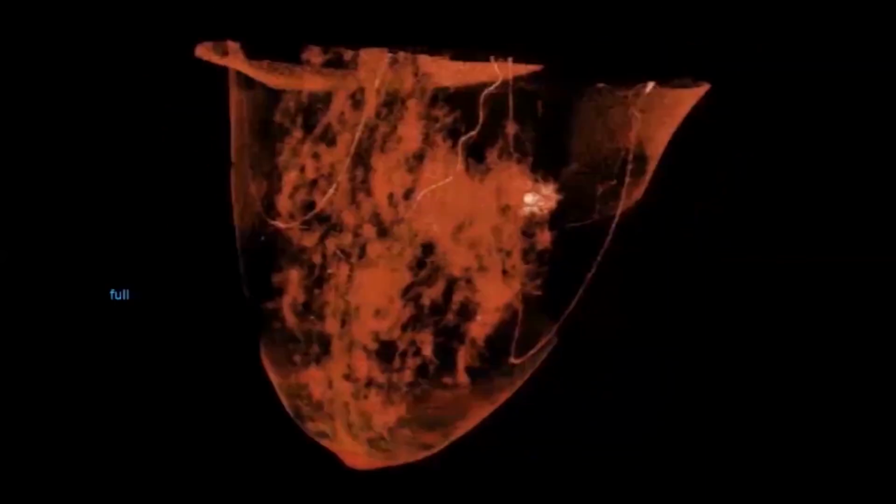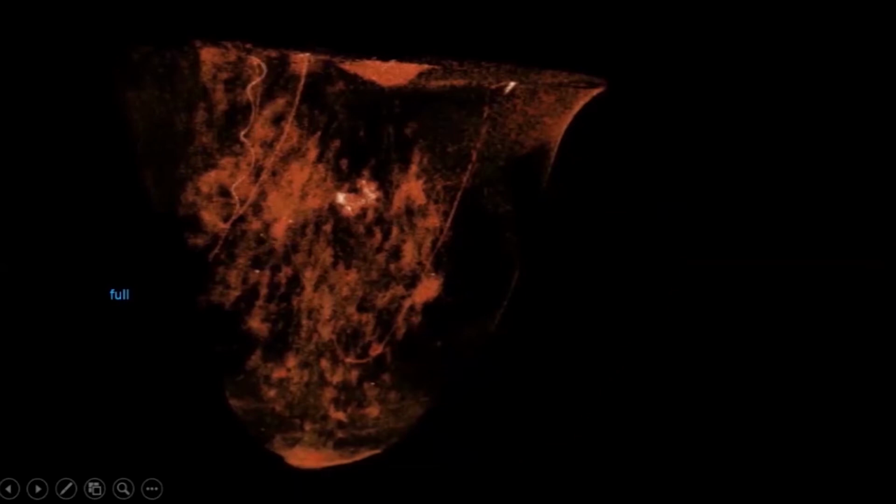And also this rotating and 3D manner of the imaging gives you a complete 3D imaging effect the first time we are doing senological imaging. This is not comparable to anything I have seen before. And stopping the rotation, you see the tumor, you can pick up the size of the tumor, you can correlate it with all the other structures in the breast, even with some microcalcs, which are benign, by the way, and some vascularization.